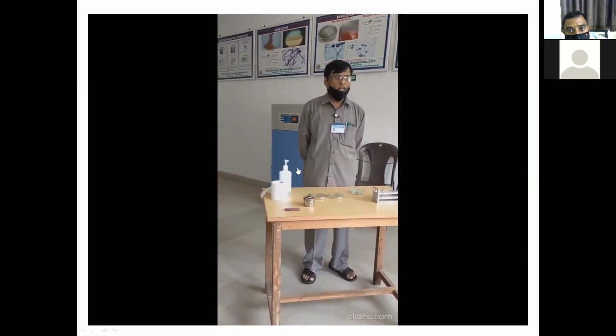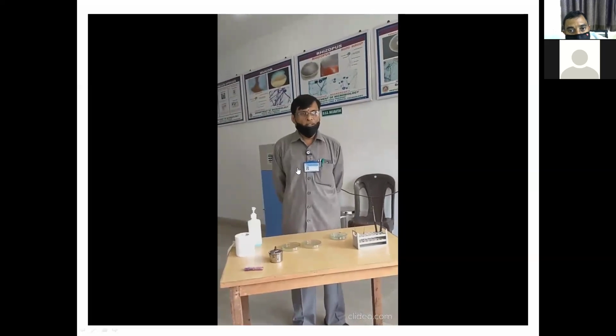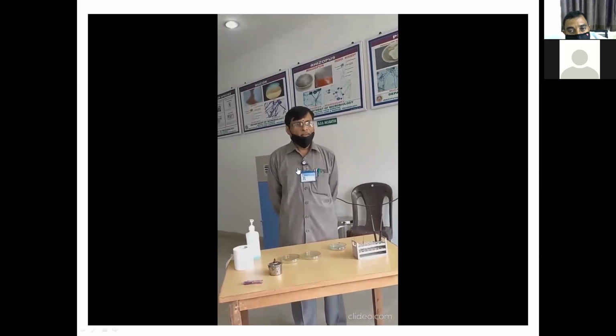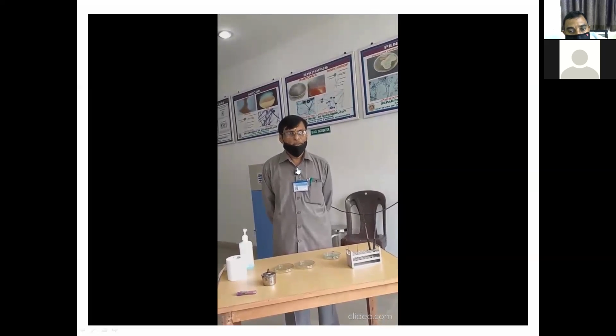Basing on the morphology, we will go to the atlas and identify the fungi at the species level.